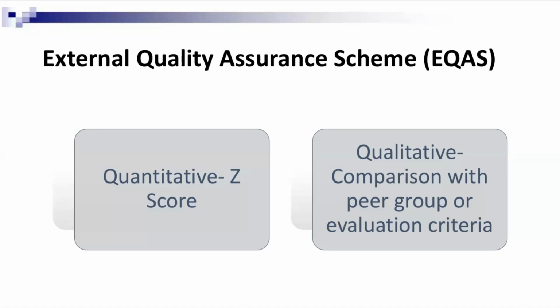Suppose 90 are saying sputum for AFB positive, 10 are saying negative, so it is okay. Then those 10 have to see why they are not able to see AFB in that. Or 90 are saying negative, 10 are saying positive. So what exactly they were observing, which they are considering as AFB positive? So that way, in qualitative, we go by majority.